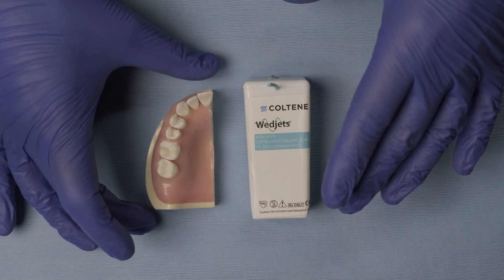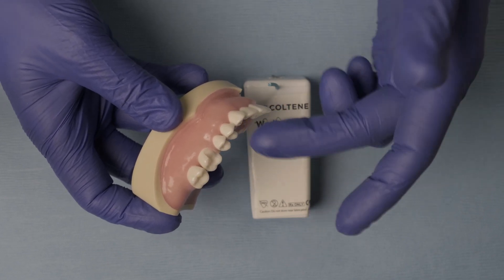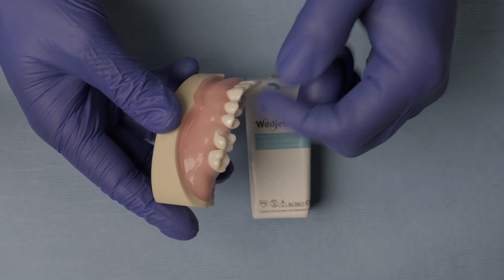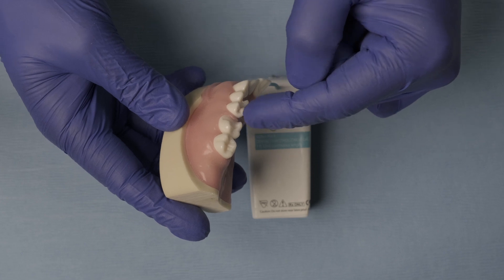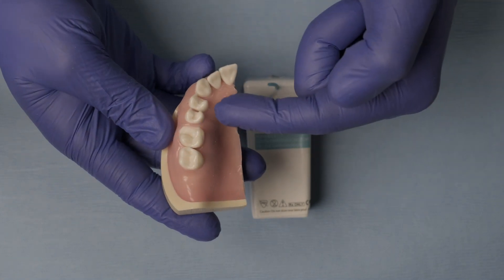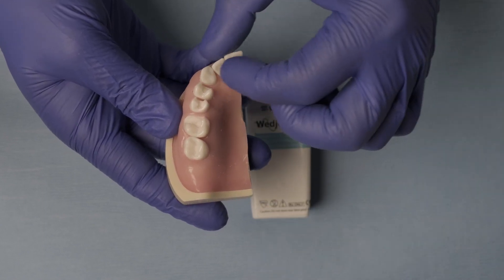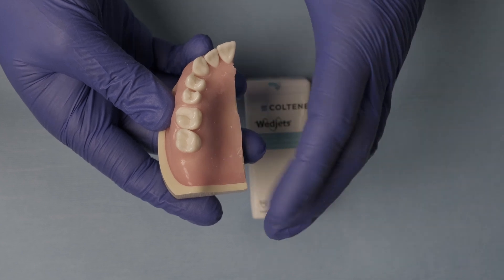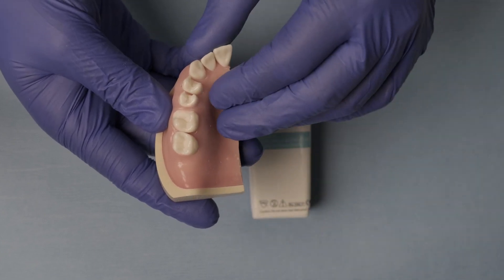For this clinical example, I'm using a different sectioned denteform with more teeth. On this maxillary first molar, tooth number 3, you can see that the gingival margin is covering the actual gingival floor of the preparation — this is a subgingival margin. We're going to place our W3 clamp here, but we also want to secure the rubber dam mesial to the working area so that it is never displaced if the patient closes, moves their lip, or anything like that. Once we accomplish good isolation, we don't want the rubber dam to go anywhere.